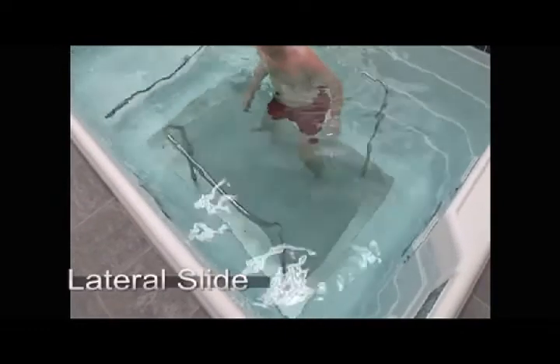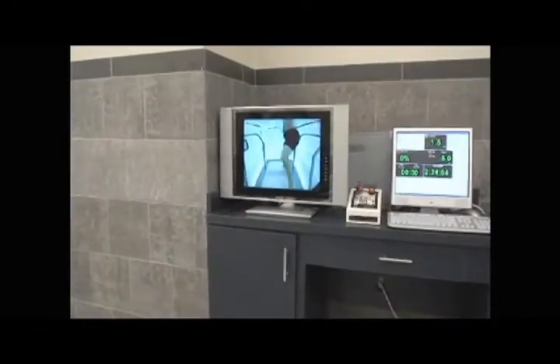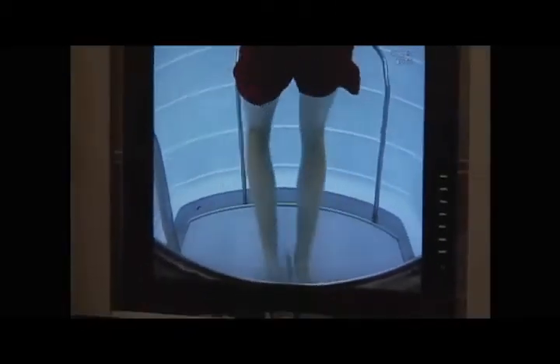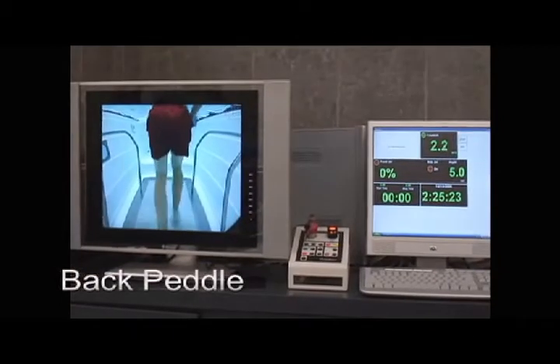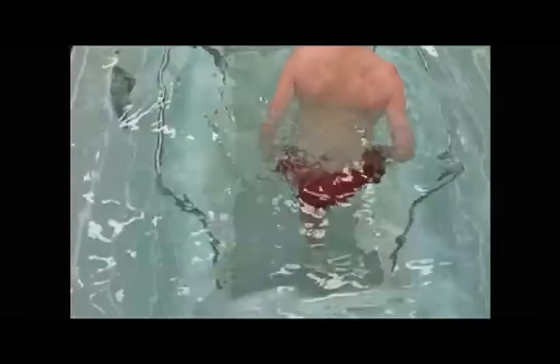Andy's facing me, gets down in a defensive position just like playing defense in basketball, and we're working on defensive slides. We did that for about two and a half minutes one way, then switched him around for two and a half minutes the opposite way. After that we started back pedaling — sped the treadmill up to about two and a half miles an hour. These are all sports-specific exercises needed to return to basketball. We did that for about two minutes.